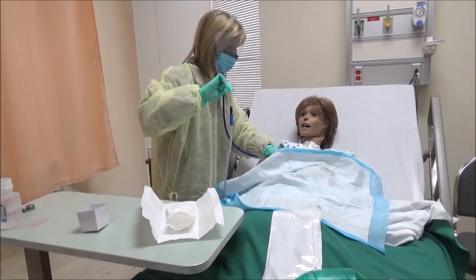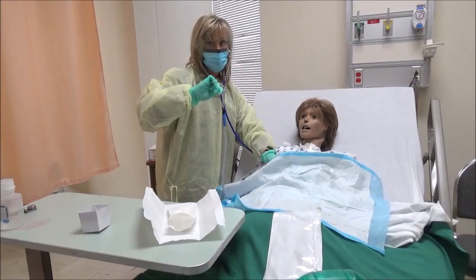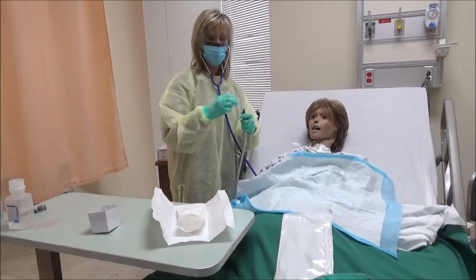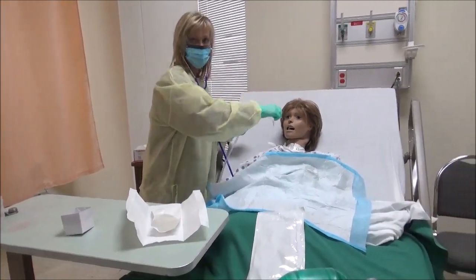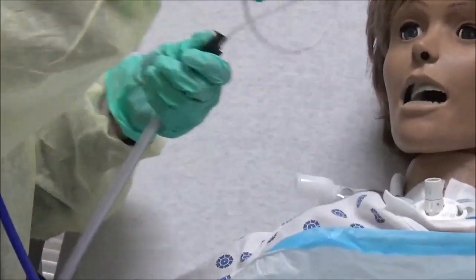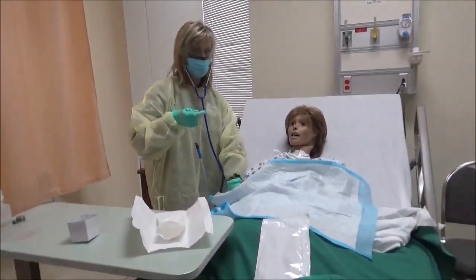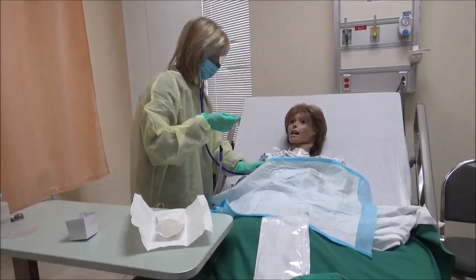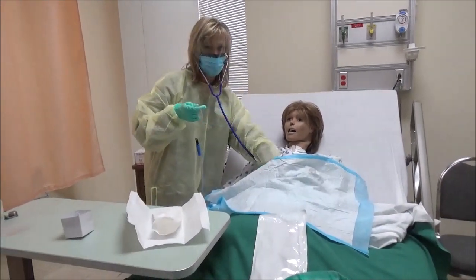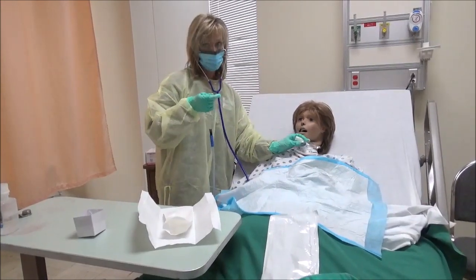So I reassess my client. And let's say at this point they need suctioning again. I would simply, because this is clean, go back down into the trach again, just like I did prior. Suction intermittently on the way out, and I would reassess my client again. At this point, we'll say that my client's lung sounds are now clear. I want to immediately put the oxygen source back on.